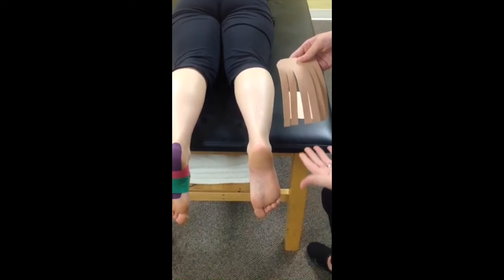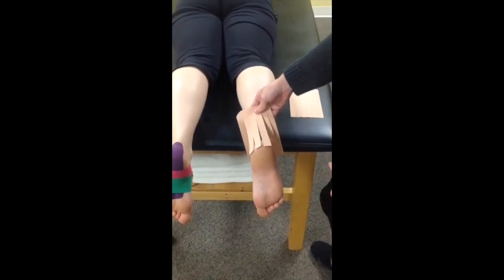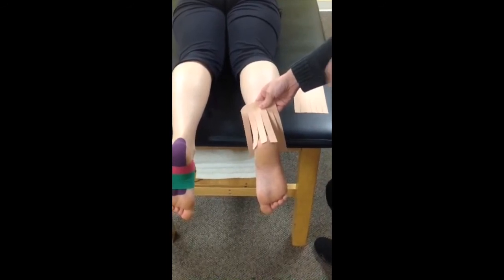So what we're going to do — anytime you're doing this technique, you just want to make sure that this part is always towards the heart. The theory behind this tape is it provides lift to the tissues and kind of pulls all the blood flow and the swelling to the heart.